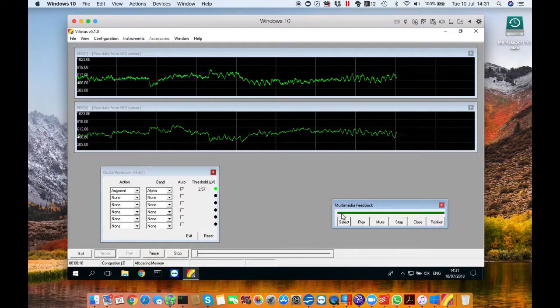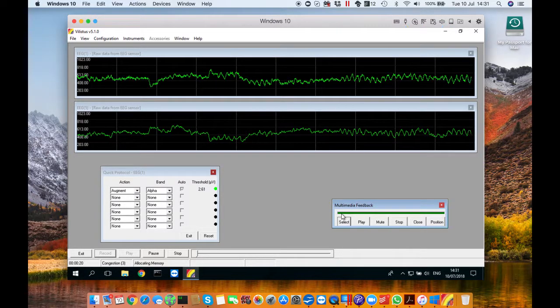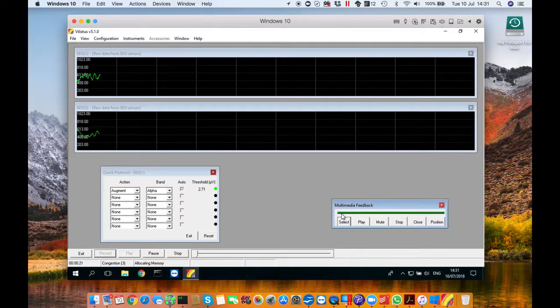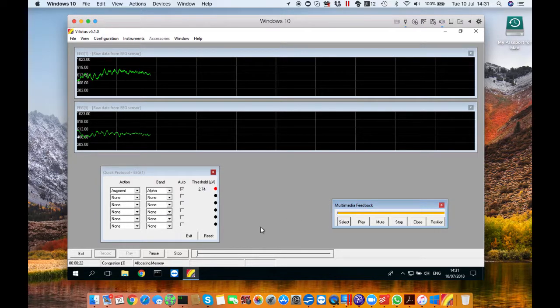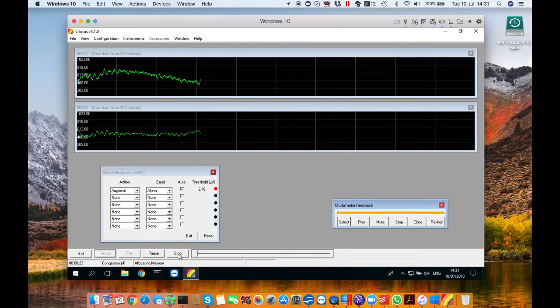You'll notice when it goes red the music you're listening to will cut out giving it kind of a jittery effect. The idea is to keep the music playing.